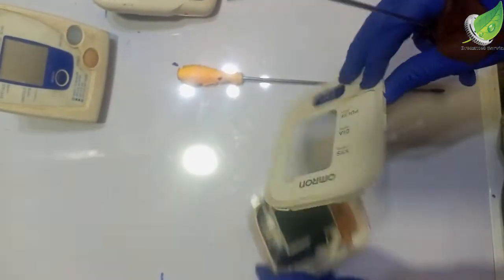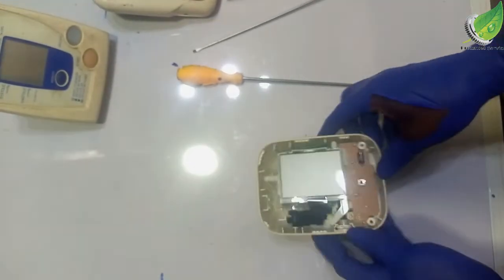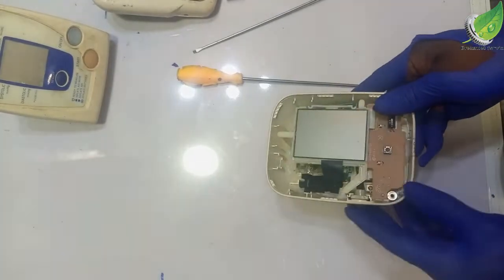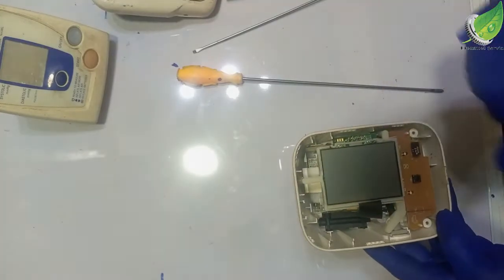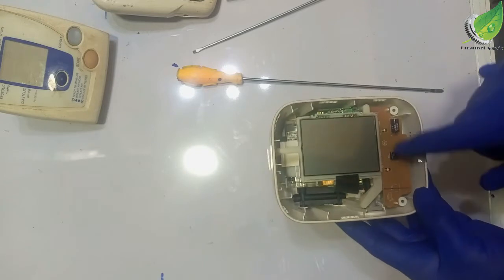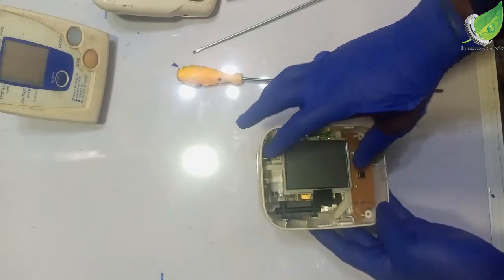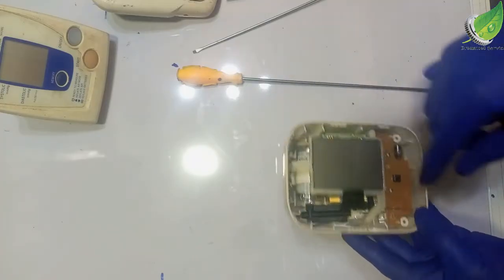So this is the top cover. Now what we want to look at is there is a valve here that is connected to the pressure pump. So most likely there is a leakage around that area. So be careful. This is a screen. Be very, very careful when handling this screen.